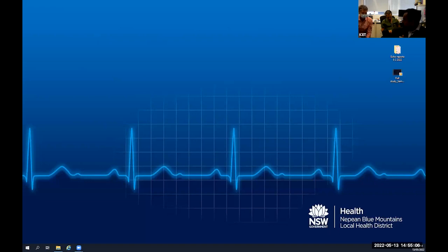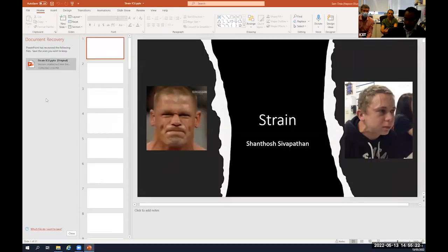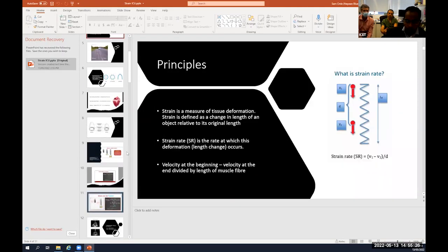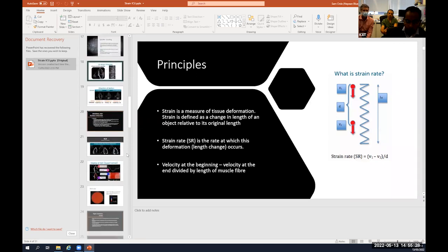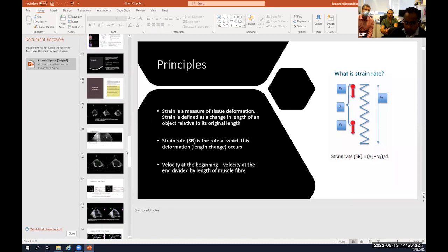It's a marker, you said, of left atrial function. It also gives us an idea of what the reservoir function is, particularly the size and how it changes during atrial systole. There's not a lot done in the critically ill. We're trying to have a look at it. It's touted as being the most sensitive marker of atrial function and of acute raised left atrial pressure. So I think it's got some real prevalence potentially in the septic cardiomyopathy literature.